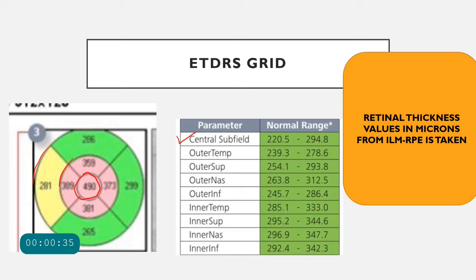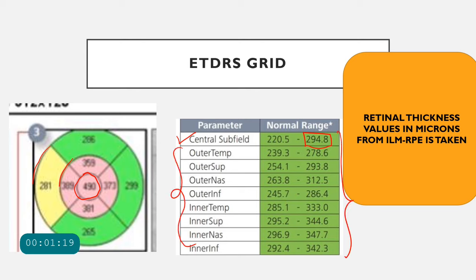The patient's macular thickness is compared with normative data already fed into the machine — a range of macular thickness seen in the normal population. This comparison produces different color codes: green indicates the safe zone, yellow is moderate, and red indicates abnormal macular thickness — the danger zone. The normal central subfield thickness is approximately 220.5 to 294.8 microns. The various other sectors and their normal ranges are also given in this table.